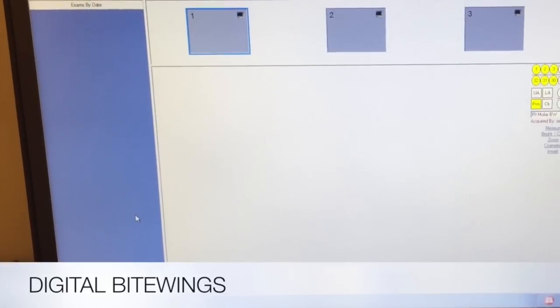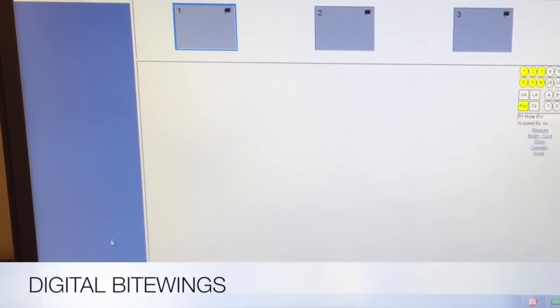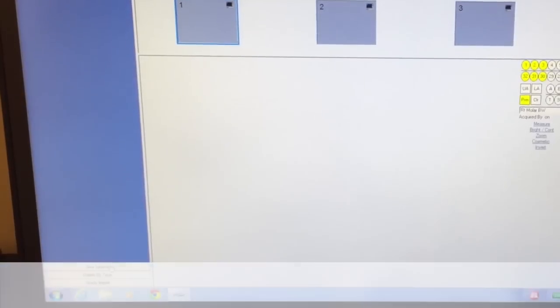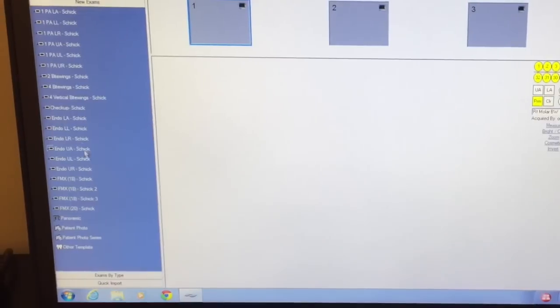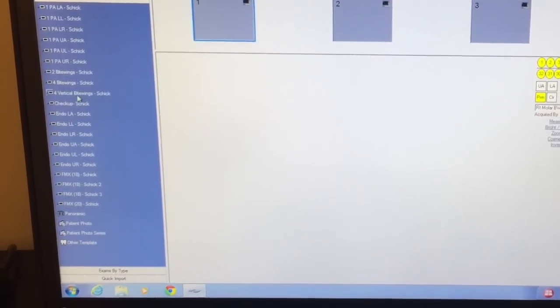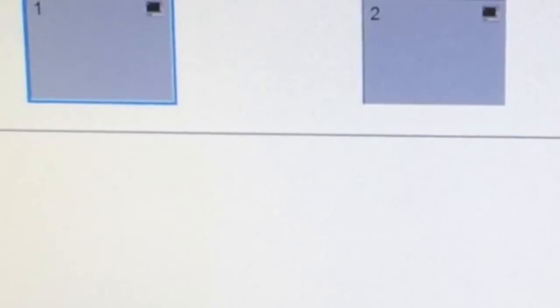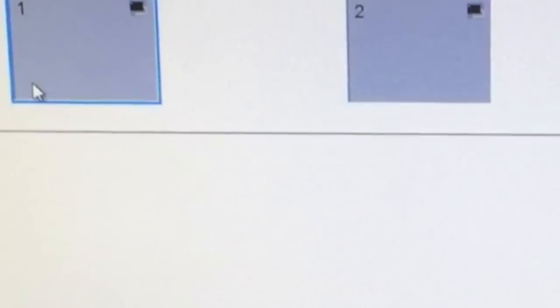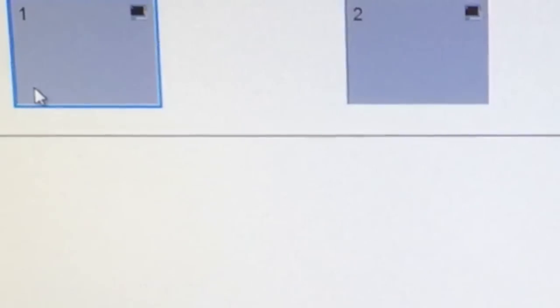We're going to take a set of digital bitewings in the Patterson software. To get four bitewings pulled up, you go to New Exams and hit four bitewings — not verticals, we're going to do horizontals. You'll know it's ready when it's blinking blue/yellow.